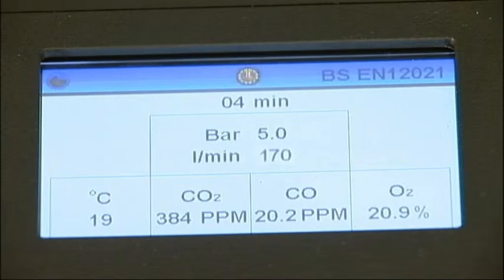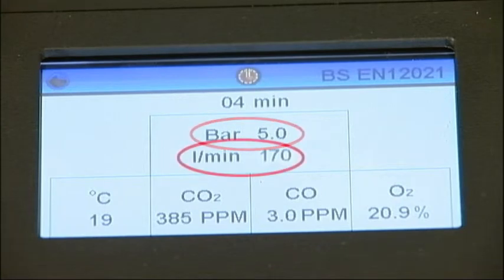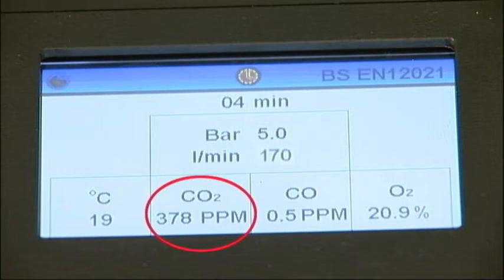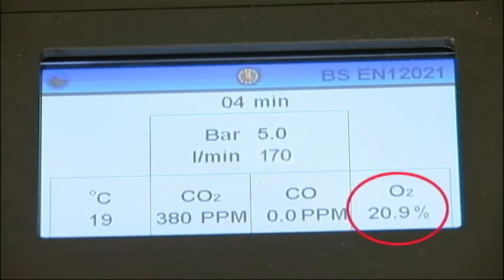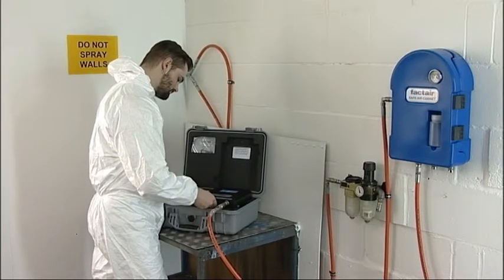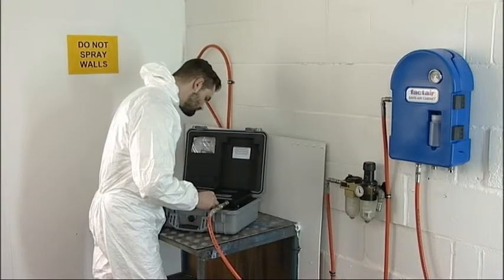The test will now begin. The remaining time will be displayed as a countdown together with pressure, flow rate, ambient temperature, carbon dioxide, carbon monoxide and oxygen content. The unit can be left until the test time has elapsed. Once the test is complete, close the flow control valve. The readings from the impactor can now be entered.